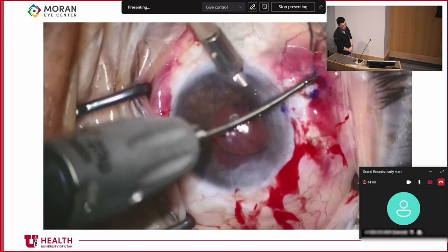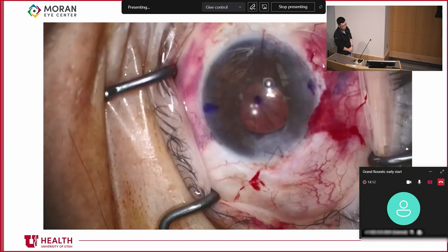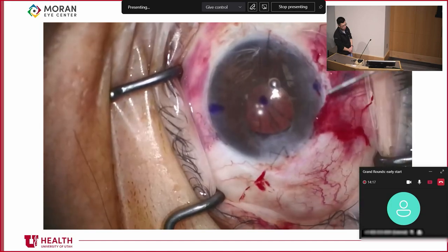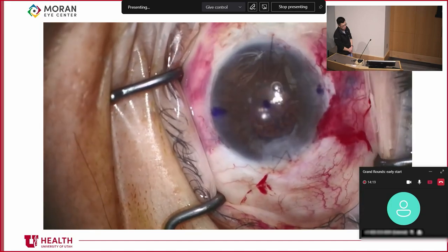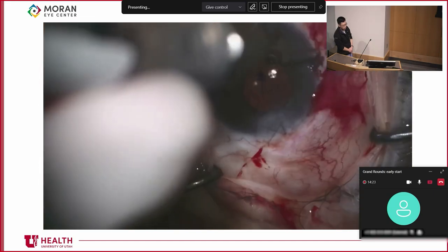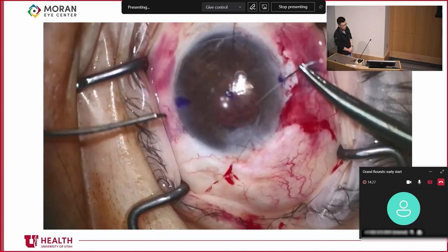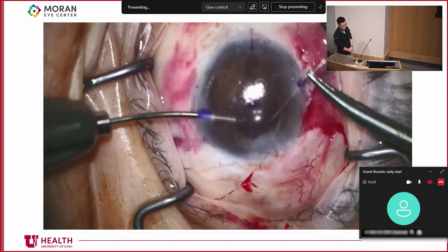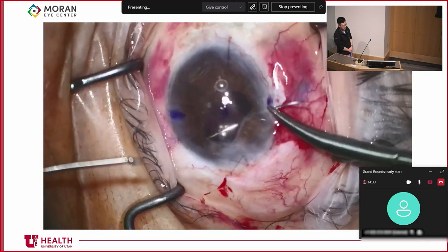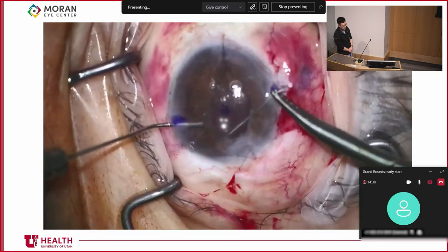The haptic bulbs created by the PMMA lens flange technique are a little smaller than the bulbs for the CT Lucia 602, so that's something to be aware of. Additionally, the haptics can be a little more difficult to work with, which is also why the CT Lucia lens is used, because the PVDF haptics are a lot more flexible and easier to use with the Yamane technique. But this lens centered really nicely and looks really good in the eye.